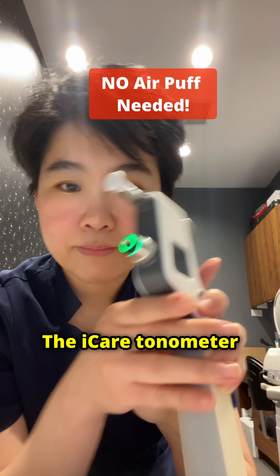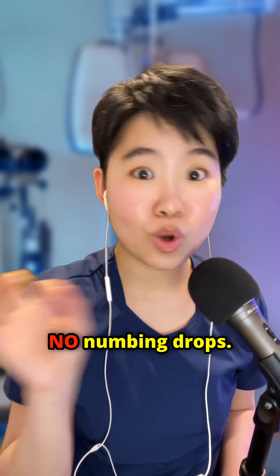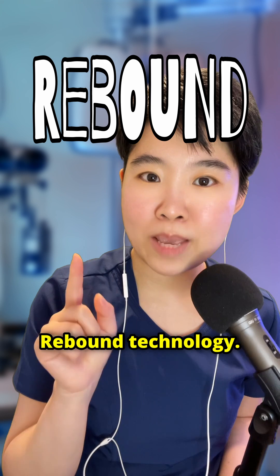Not everybody can do that. The iCare tonometer is portable — it will not puff air, and it requires no numbing drops. It uses a rebound technology.